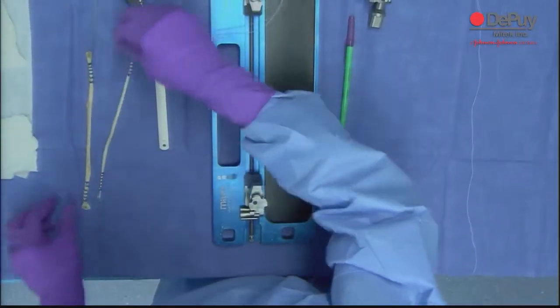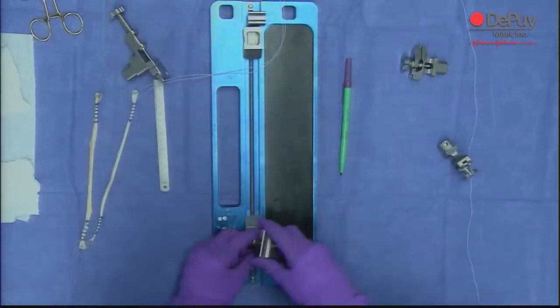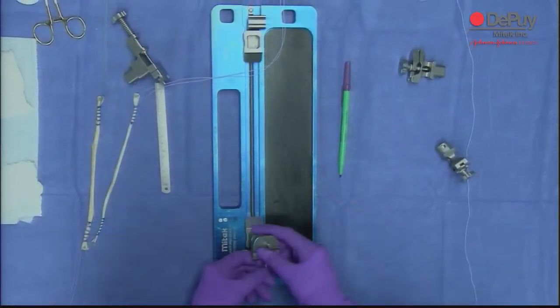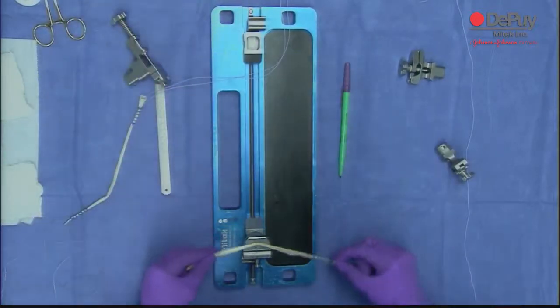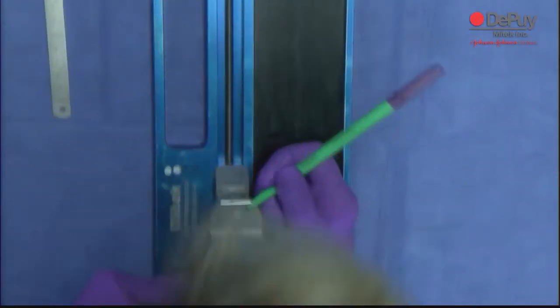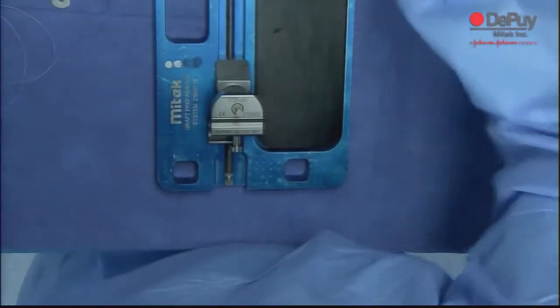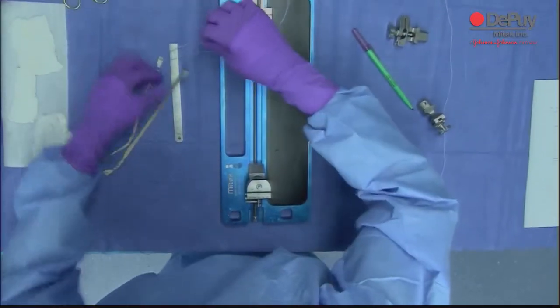Now we've got two grafts. Now what you have to do is mark the middle of the graft. The easiest way to mark the middle of the graft - I've seen people lay it out, measure it, everything else - the easiest thing to do is go like this. There's the middle.